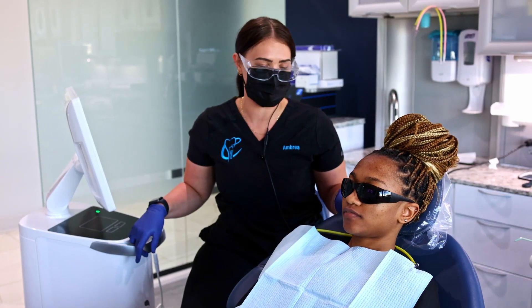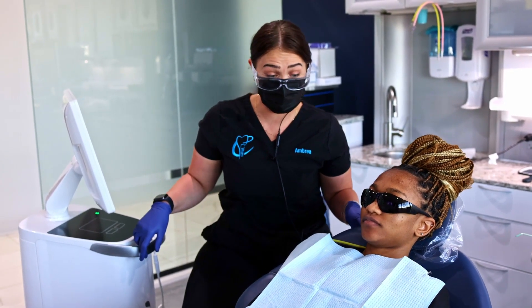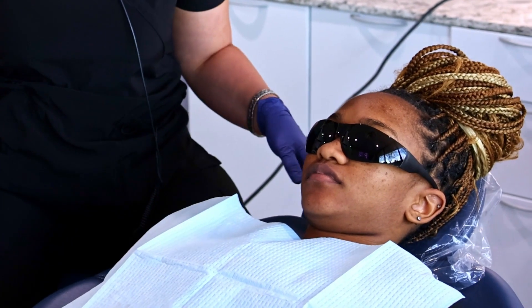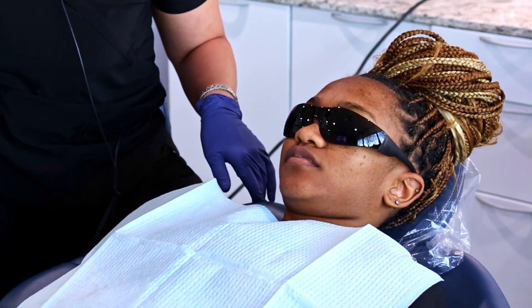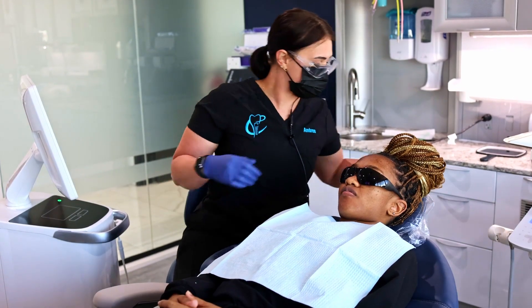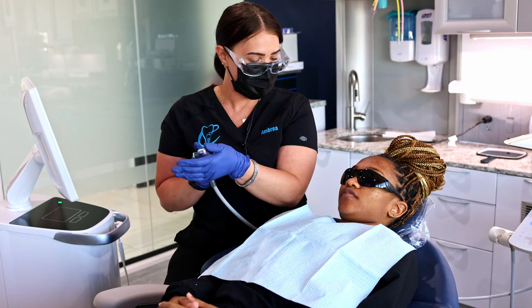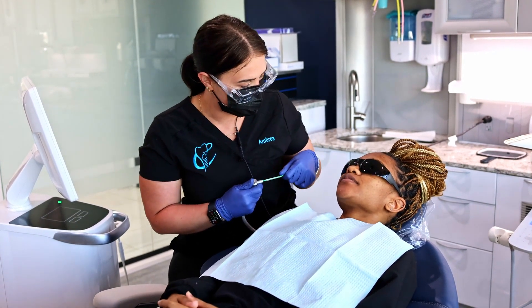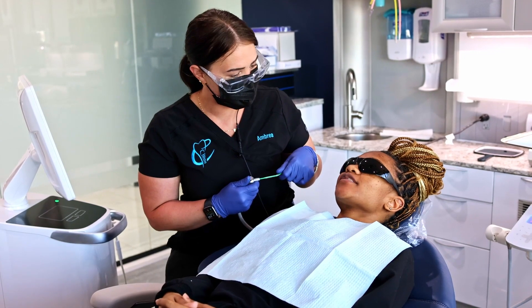Alright, Nadia, so today we're going to be doing a scan of your teeth. We're going to use this to send off to the lab so they can make your guide. The first thing I'm going to do is just dry off your teeth a little bit — use this air here and just kind of go along the surface of your teeth. Do you have any sensitive spots? My front teeth. Your front teeth? Okay.